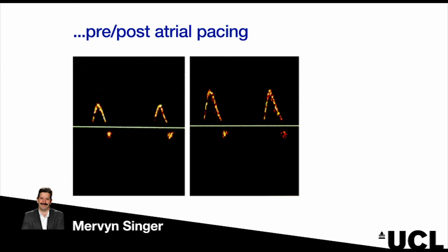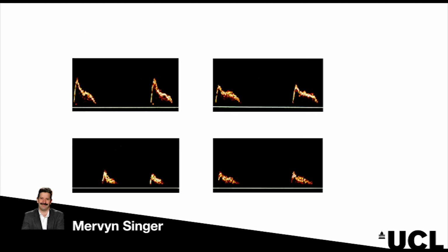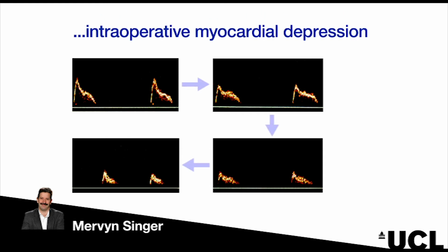This is another patient having cardiac surgery who had progressive myocardial depression. His heart didn't like being fiddled with by the cardiac surgeon. So you can see over time there was this progressive diminution of his stroke volume, the peak velocity went down, and then it got to such a point, it was so bad, he needed to go onto an emergency bypass. This was in the very early days of our learning curve, and we were able to then recognize this and intervene much earlier. We didn't need to allow his circulation to deteriorate to such a parlous state.